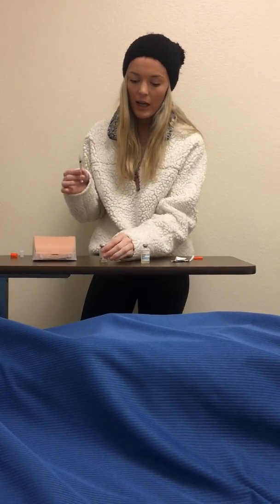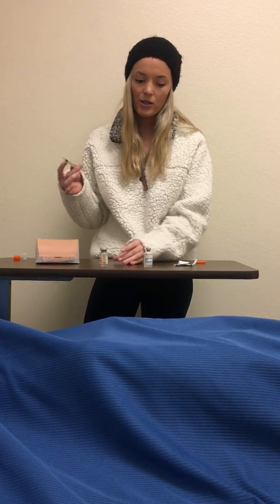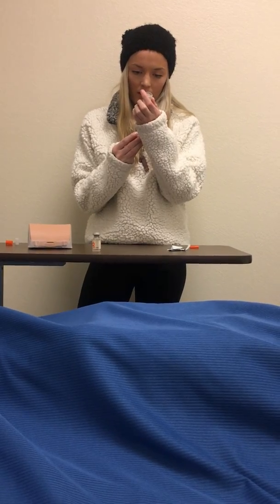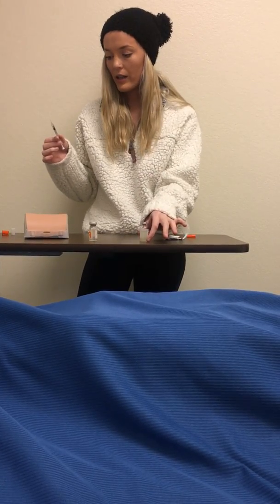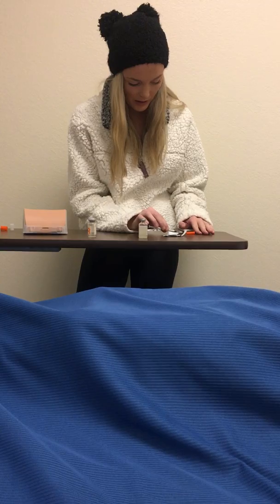Okay. Now I'm going to have another nurse with me. She's going to verify that I drew up the 10 units of the regular insulin, and if we have badges and we're using the CMAR, she can scan her badge too. Then I'm going to inject it back into the cloudy and draw up the rest of the 10 units. Pull that out. She's going to verify that I drew out 10 units of the cloudy insulin and that the total equals the right amount that I'm supposed to be giving. Then I'm going to recap this without touching the table.